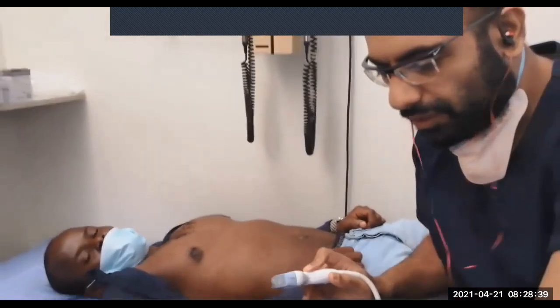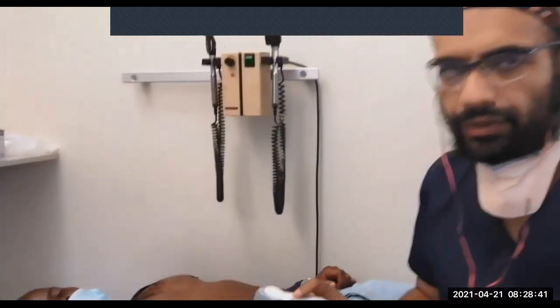So today what we're going to practice is a full echo, all right? A bedside echo.